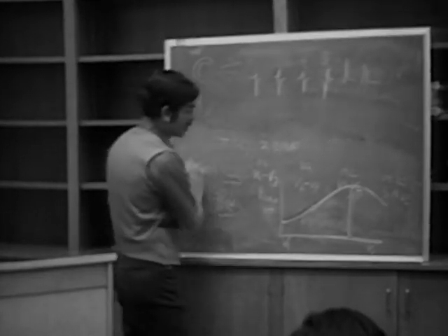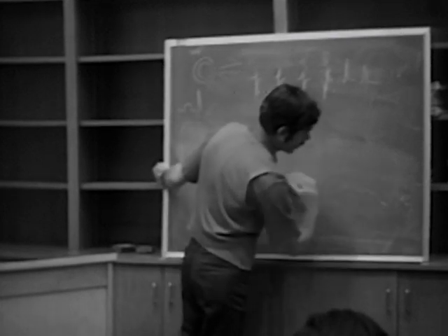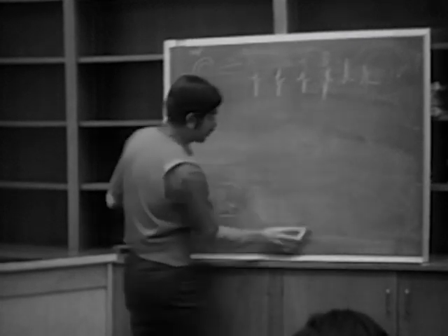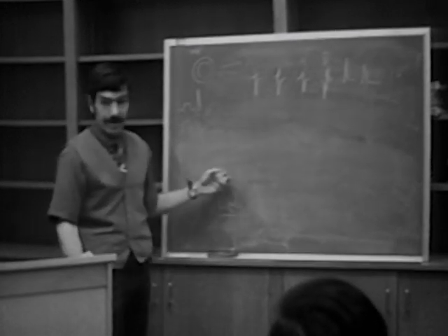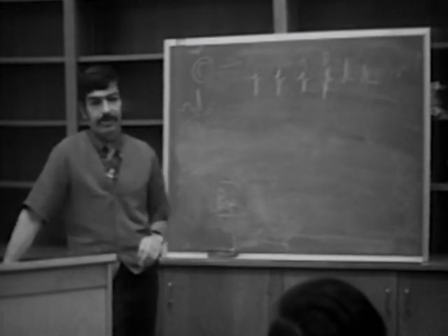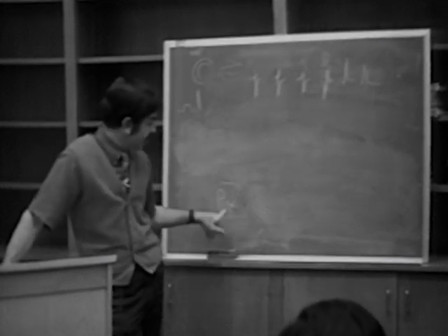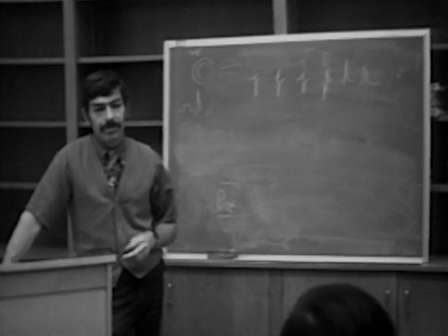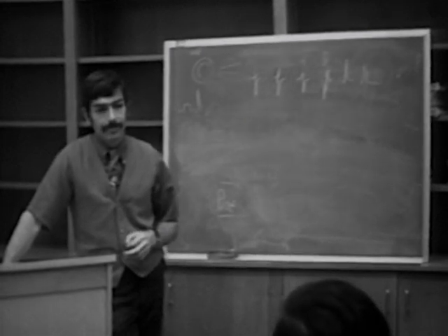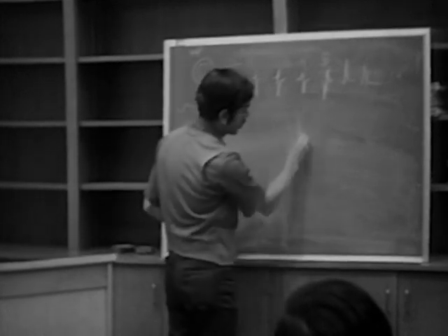All right. Okay, now let's localize one final area here. Most of your infarcts, by the way, your transmural infarcts, are either on the inferior or the anterior surface. I'd say that covers, or the transmural probably covers over 90%. Rarely you'll find someone that has what they call a true posterior or direct posterior wall infarction. But it's worthwhile recognizing this entity when it does occur.